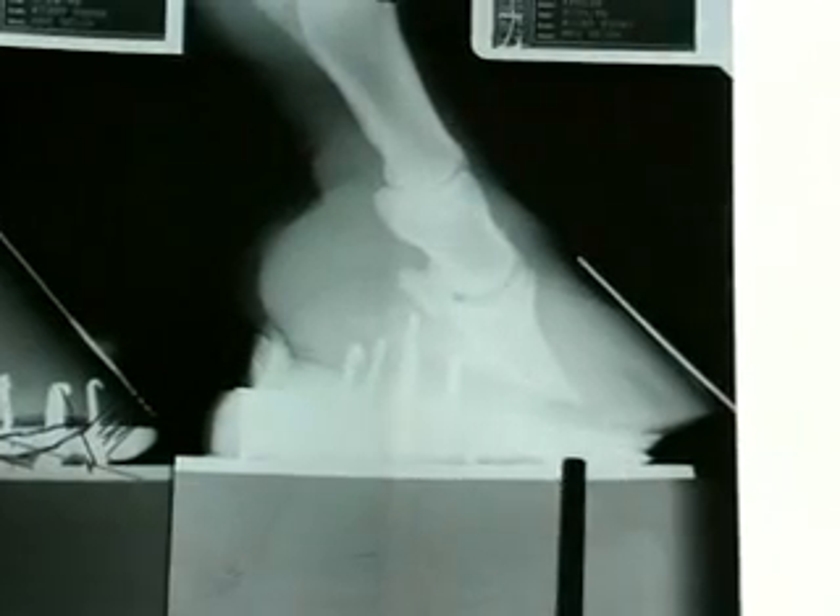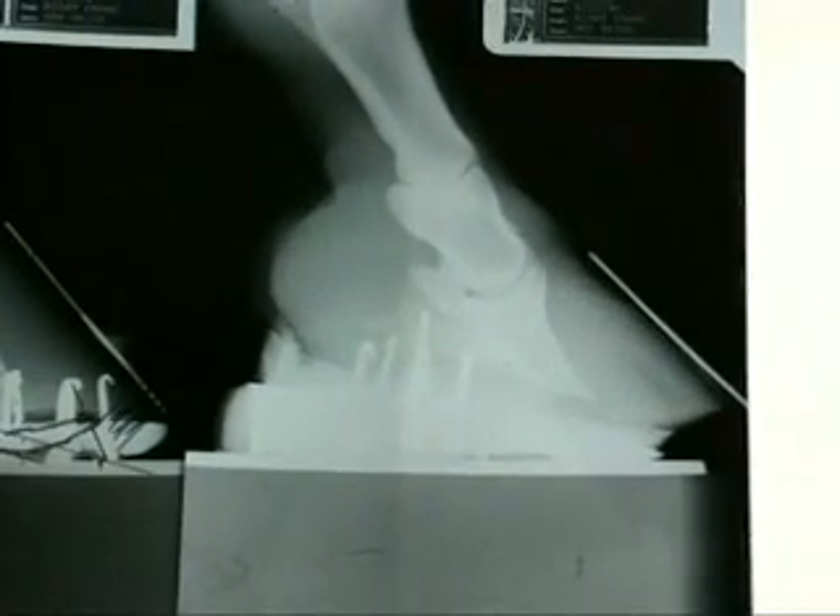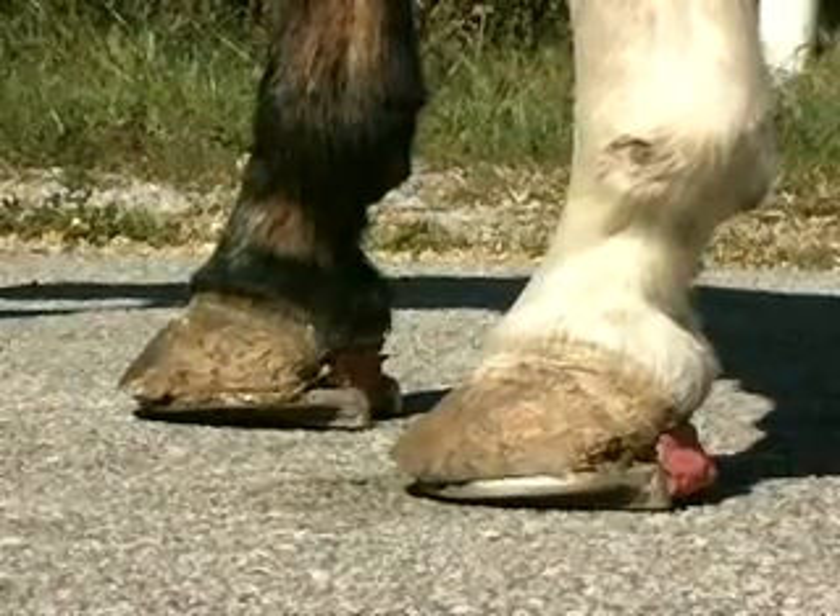If you notice, the nails are well back. She's actually nailed to the back, but she's still being in pain in front. Notice how we need a parallel line between the top of the shoe and the bottom of P3. Only slight differences are going to make a big difference with this mare.